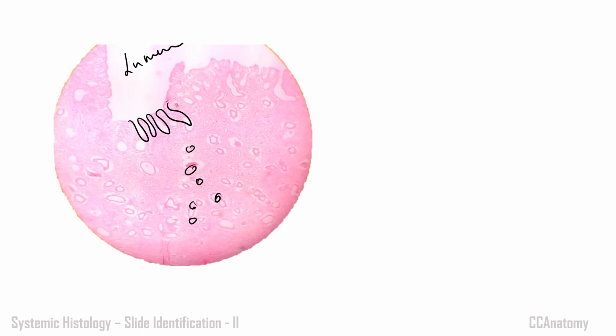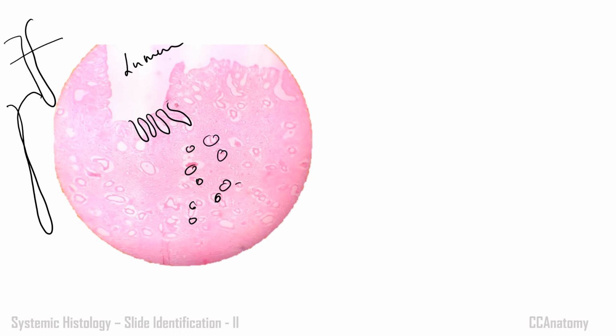These are nothing but the uterine glands, the glands which go deep inside and come back. Drawing it again: the glands go deep inside and come back again. So when the section is taken, it may not be straight. Because of its irregularity and spiral nature, you can see multiple cross sections. And the thick muscular coat will be just below this.